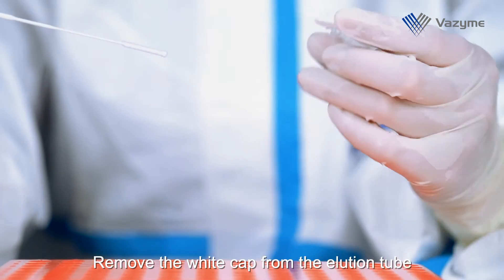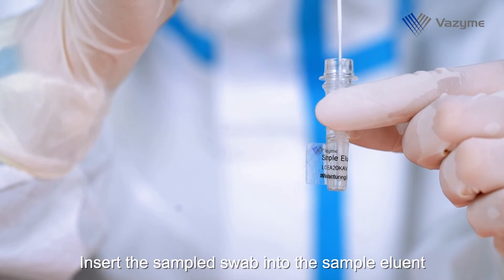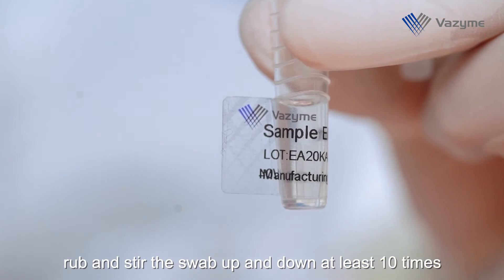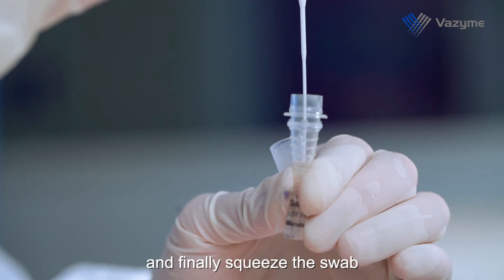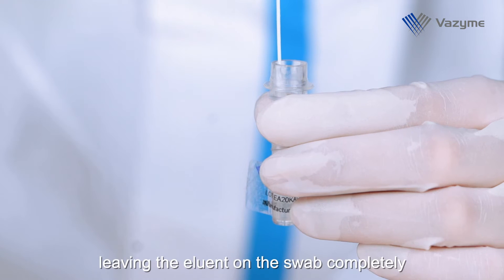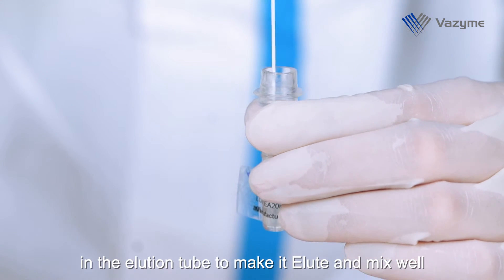Remove the white cap from the elution tube. Insert the sample swab into the sample eluent, then stir the swab up and down at least 10 times or for at least 15 seconds. Finally, squeeze the swab, leaving the eluent on the swab completely in the elution tube to make the eluate and mix well.